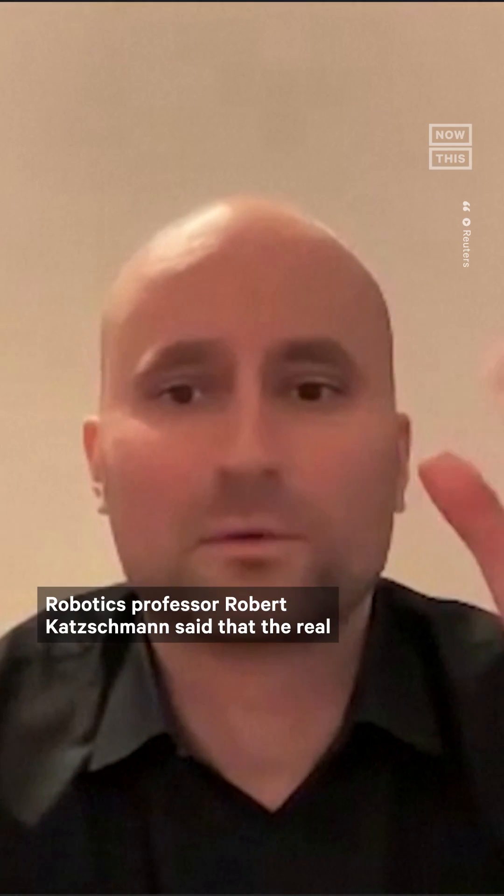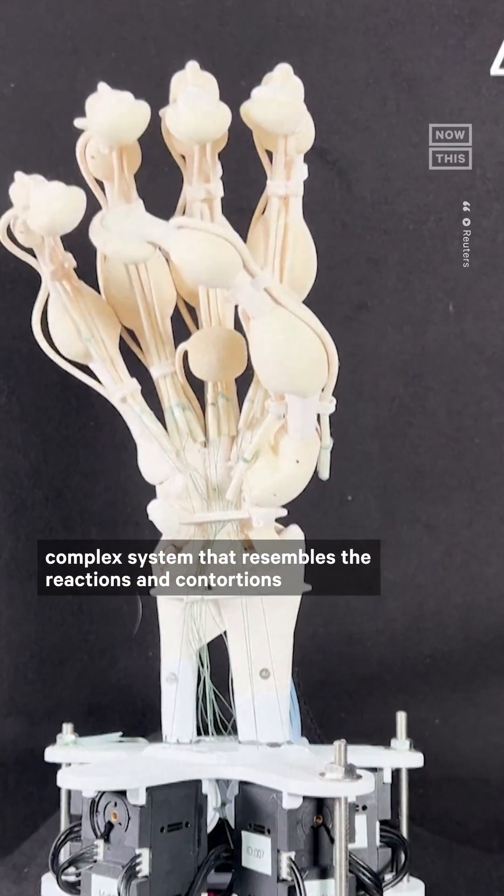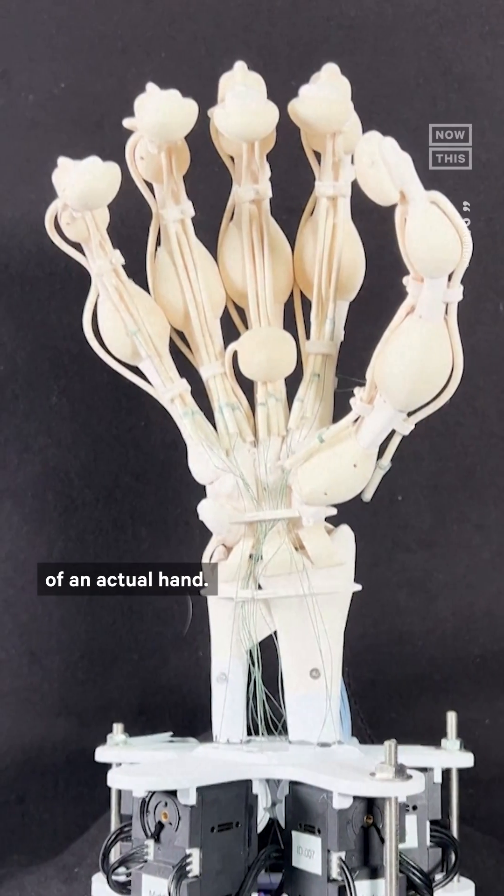Robotics professor Robert Katzschmann said that the real innovation here is the ability to create an integrated complex system that resembles the reactions and contortions of an actual hand.